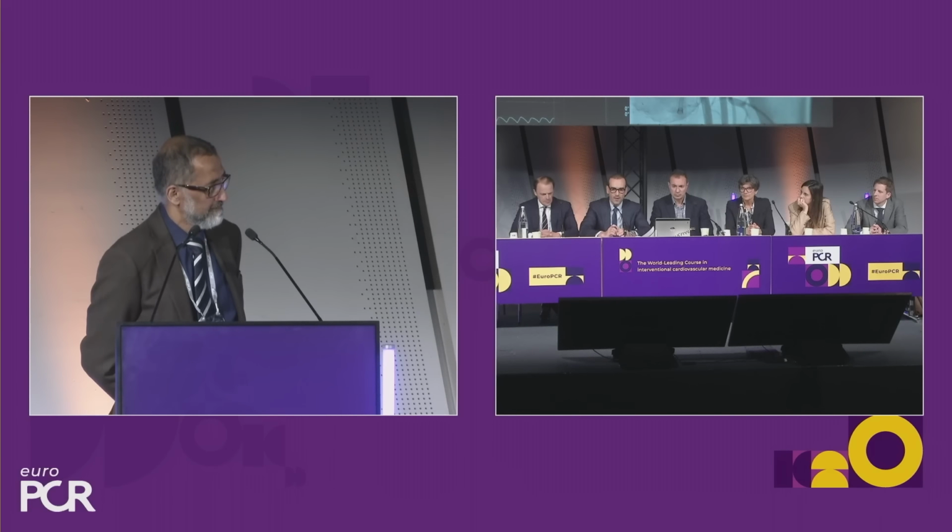I think what we've learned with the experience and with this platform is that in order to optimize the way it opens and the way it distributes the force once opening, the way we prepare the valve with balloon predilatation is crucial. And I used to do the same as you, Iqbal, let's say downsizing the balloon. But what I do more and more is to go to this approach you summarized, Simon.